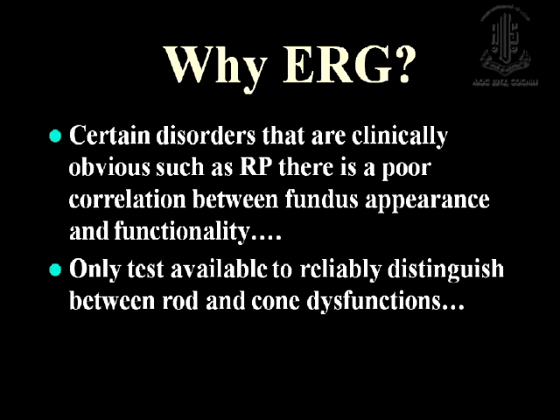So I have many people, even ophthalmologists and retinologists, who continuously ask me, this patient has RP, retinitis pigmentosa. It is so clinically obvious. Why do you want to order a full field ERG? It's a waste of the patient's time and money. I will show you some reasons why I feel it is important that you do ERG, full field ERG, even in certain disorders which are clinically obvious like RP, because there is a poor correlation between the fundus appearance and functionality. And it's also important to understand that full field ERG is the only test that we have today which will reliably distinguish between rod and cone dysfunctions.